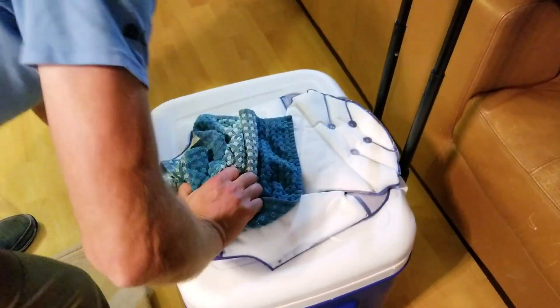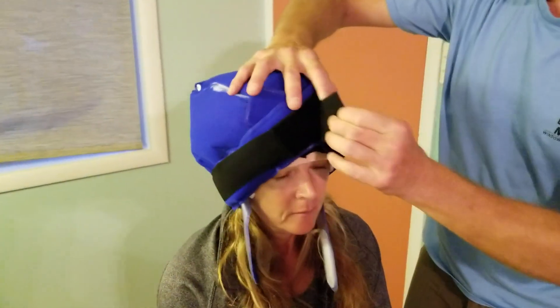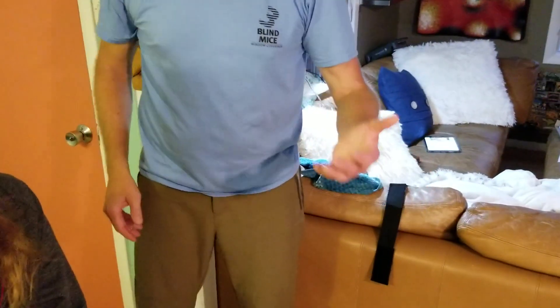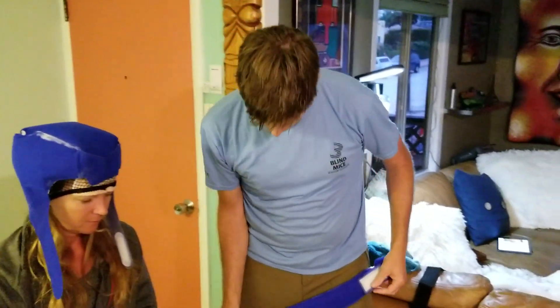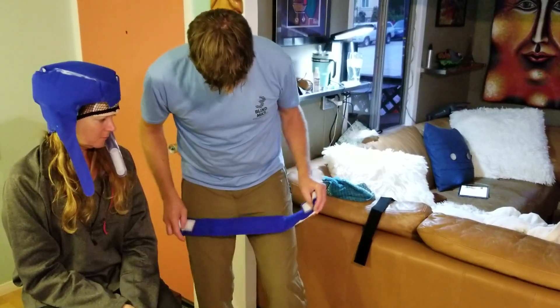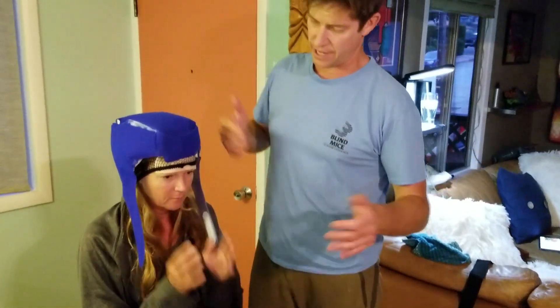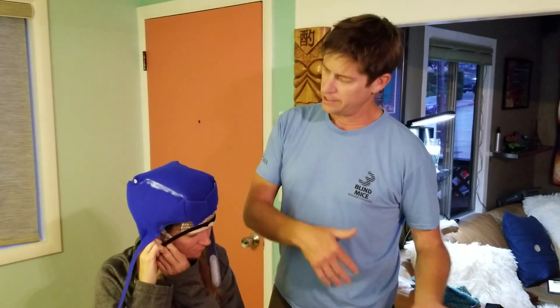Take your gloves off for this — you want to make sure there's no condensation. We've got the wraps you'll see later. Here's Renee — we take her first cap off and set it aside. The kit comes with three straps and we only use one. This is a very crucial strap — it keeps everything in. I fold the ears in like this and fold it over to get it ready to go back into the cooler. We actually drove home from the hospital and had one change on the way since it was rush hour.